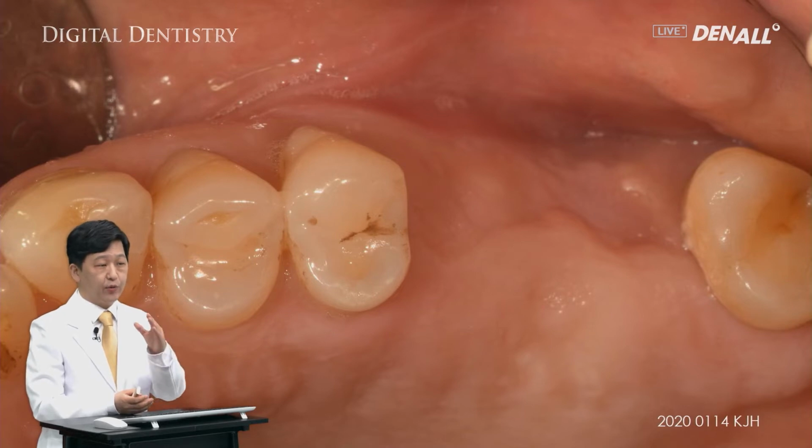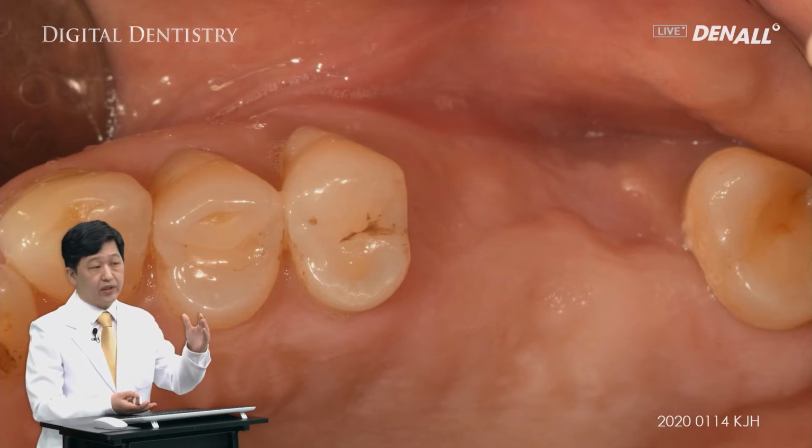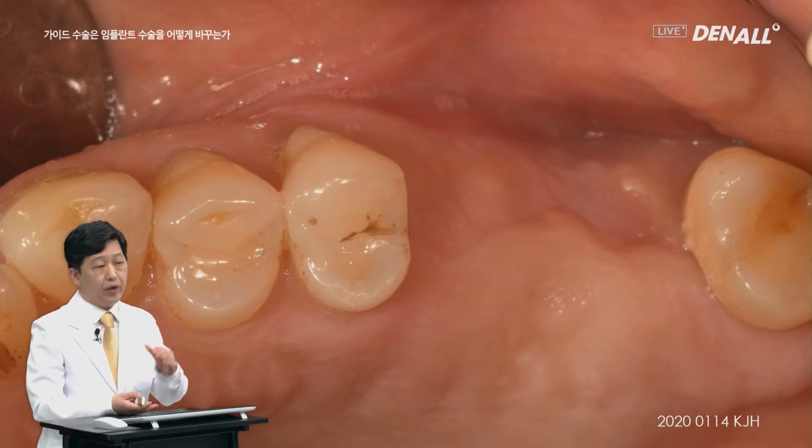Look at how the upper left second molar's buccal plate is significantly resorbed. In the past, in this case, implant would be placed and bone graft would have been done, or bone graft would have been done first and then implant would have been placed. However, these days we don't do it like that anymore, and I'm going to show you what has changed.